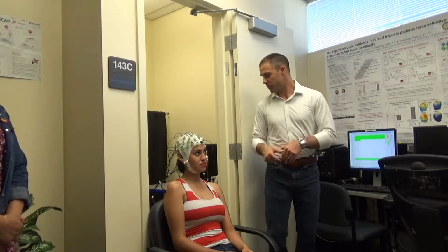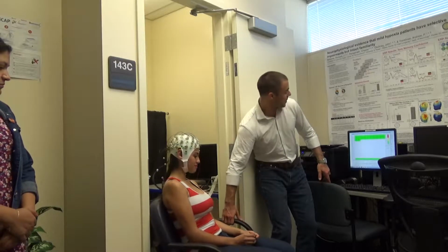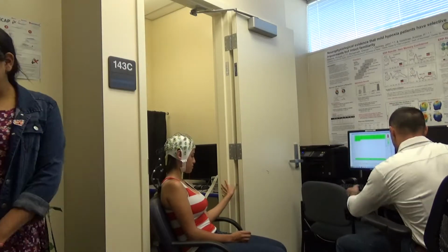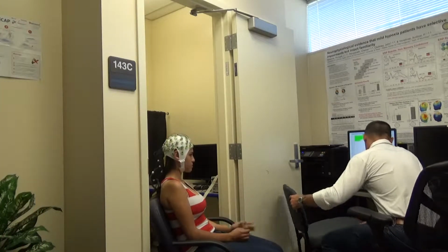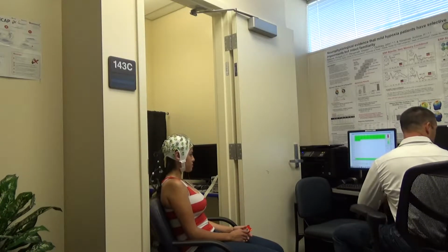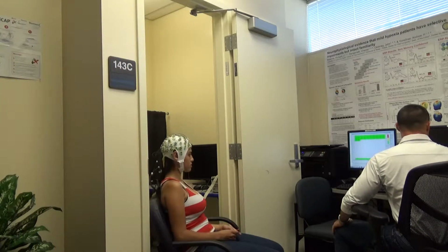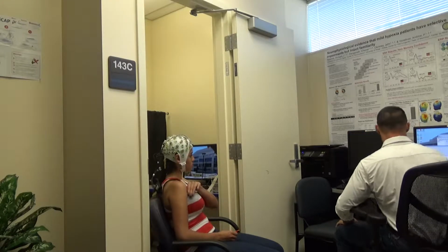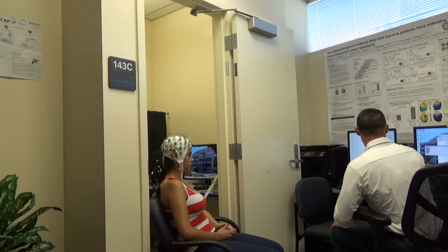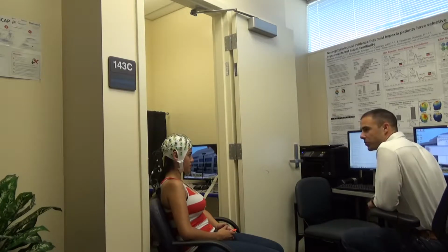Okay? So the first thing I'm going to do is very gently slide your chair with you over. Perfect. We'll just rotate you a little bit. Okay, so you can see the computer screen a little bit? Mm-hmm. Okay. So I'm going to grab this here. Okay. Let's see here. So first of all, move this computer screen on. Okay. Guess we can get out of the impedance thing. Let's go into our default mode. Okay, so you are now watching your brainwaves in action.